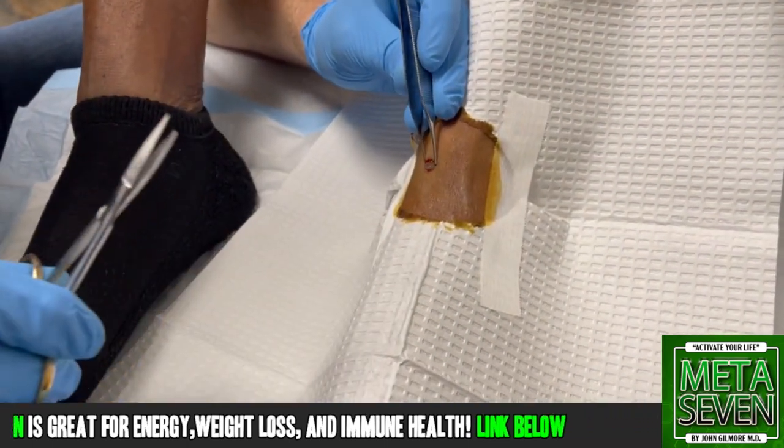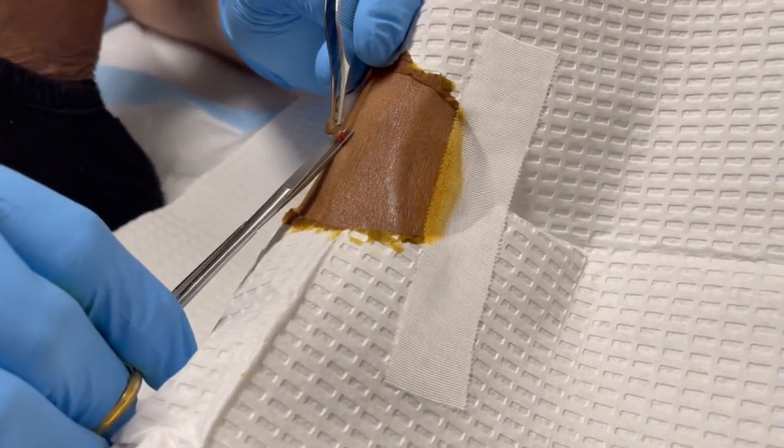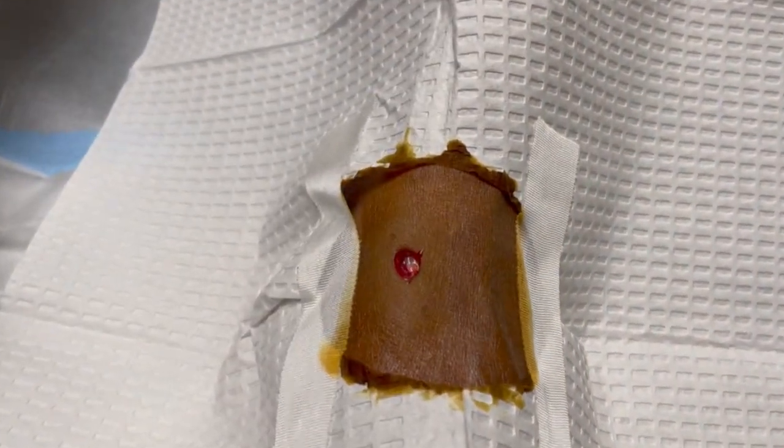So what I'm going to do is use the forceps to grab the punch. We're going to make a little snip right there. All right, now we've removed this, and we're going to go.